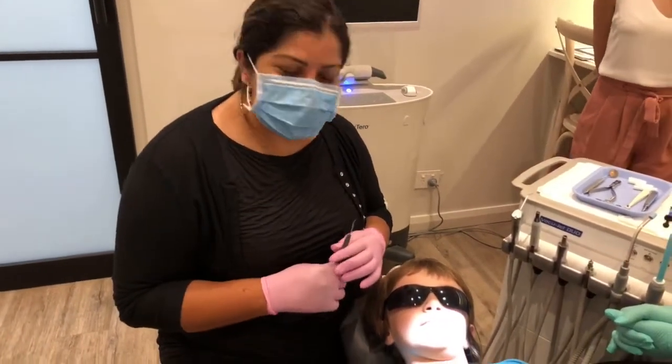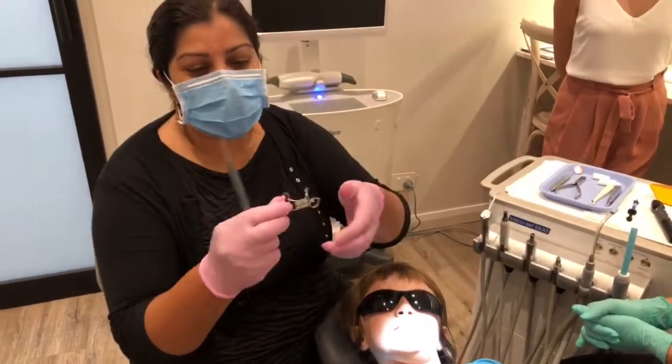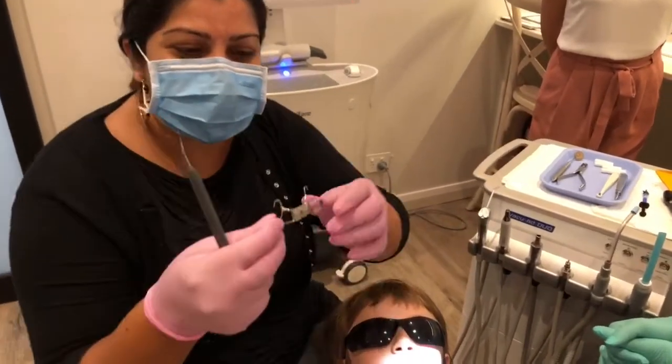Hi everyone. Today I'm going to show you how to cement an expander. We've got an RME here today and we're at CCC Smiles in my practice at Mossman.